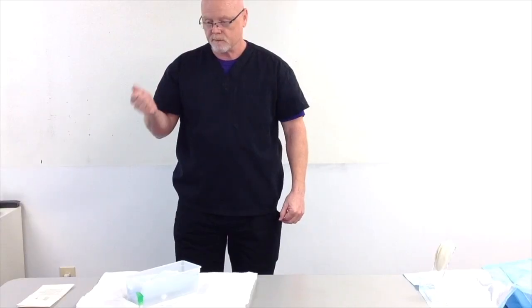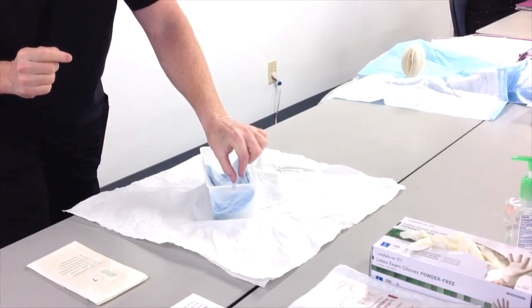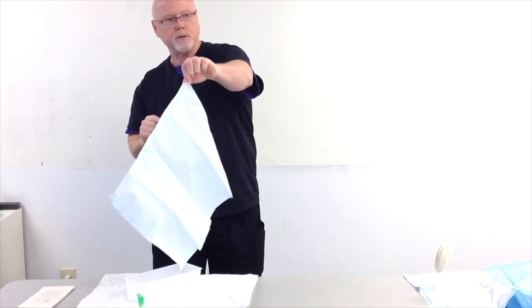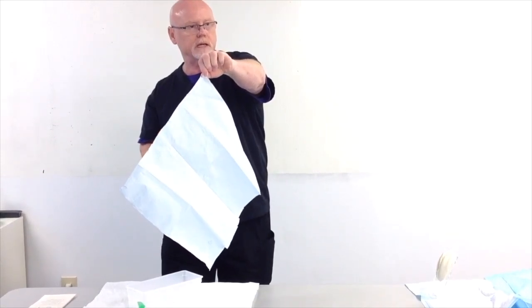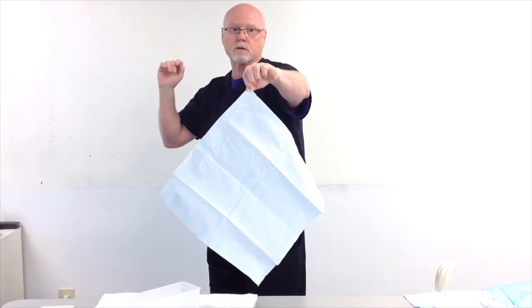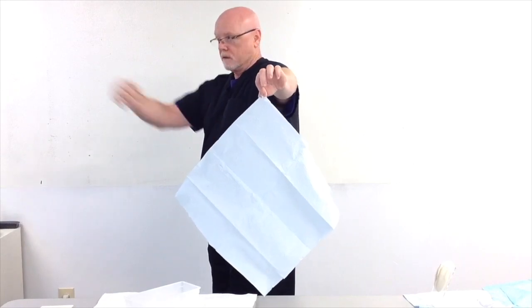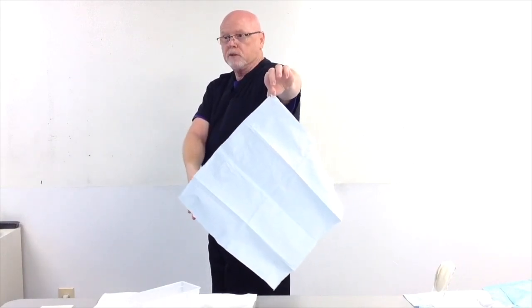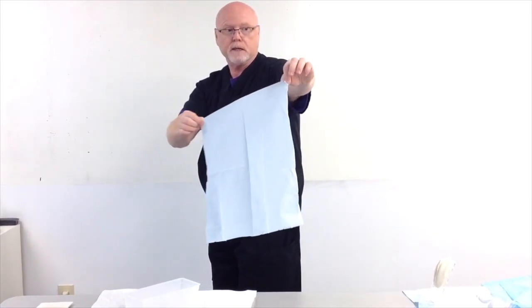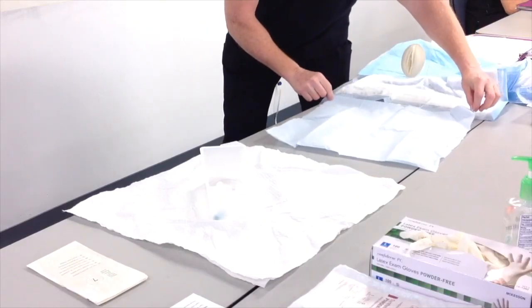And then, watch this. I've got clean hands, right? I'm going to reach in and grab the corner of this drape. As I lift it up, you'll notice that it's unfolding itself. The very next thing I want you to think about in your mind is, I'm a matador. Toro, you know what I'm talking about? The bull's coming at you, and you've got the cape to your side like this. The shiny side is facing me, and I want that facing downward. So I'm just going to drape the patient like this.